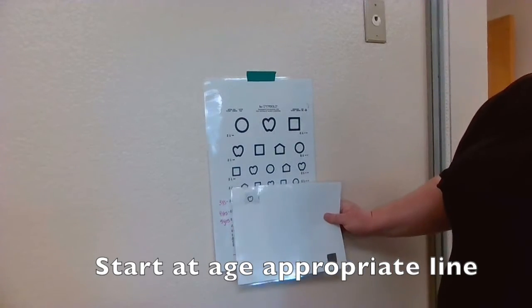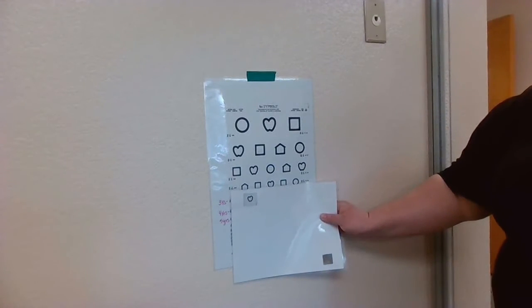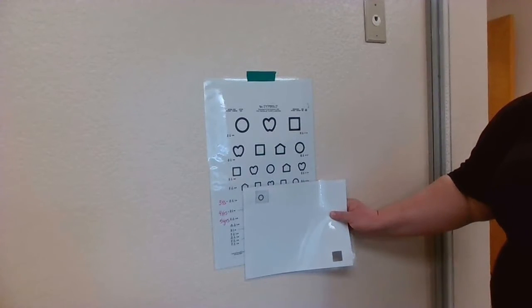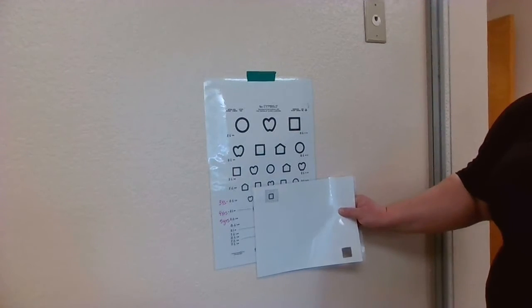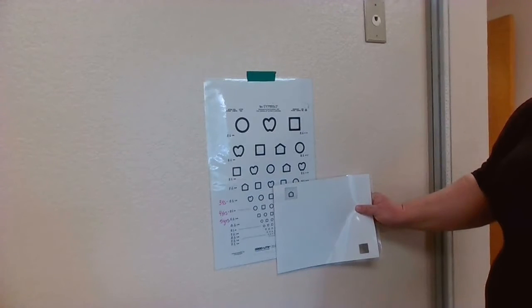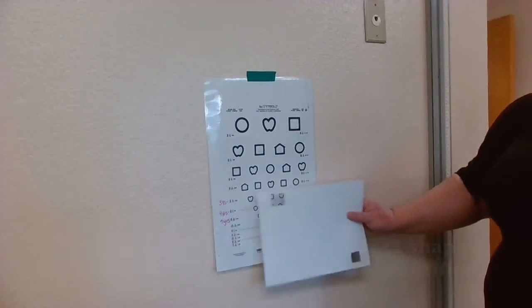Using your finger or a paper seen in the screen, start at the age-appropriate line, going from shape to shape as the child responds. Make sure to give the child time, and as long as they get 4 out of 5 shapes correct, they pass for that eye.